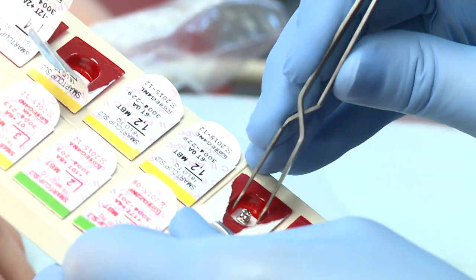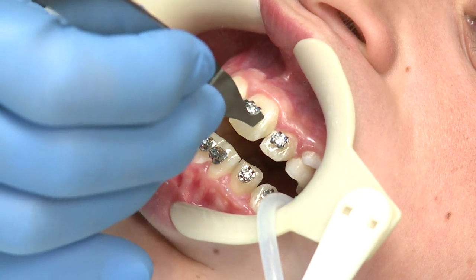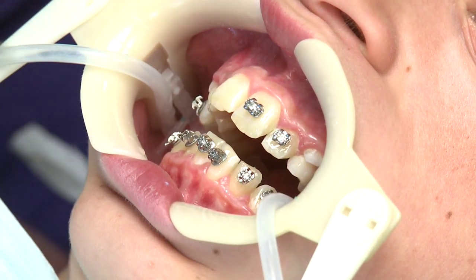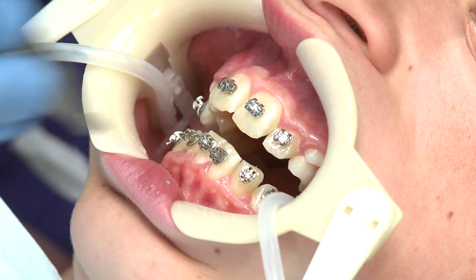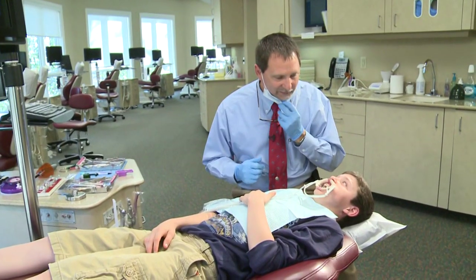Dr. Spillers will place an individually packaged bracket on each tooth. The most important part of the process is getting the bracket in exactly the right spot. Hey Jacob, we're gonna get those braces right where they need to be.